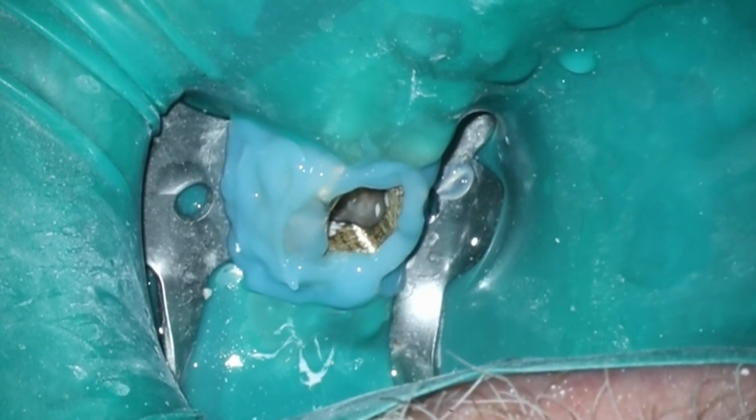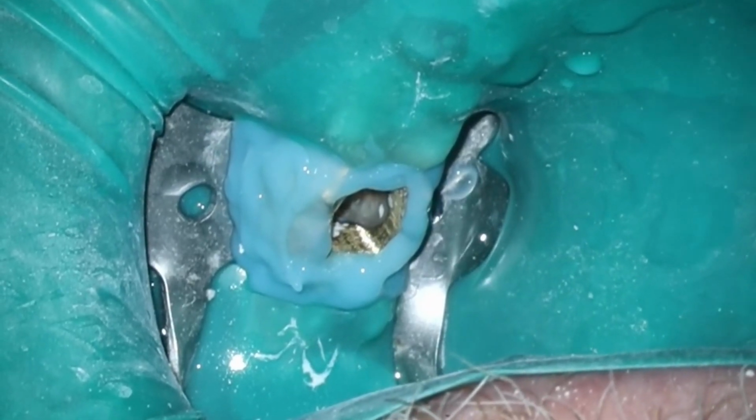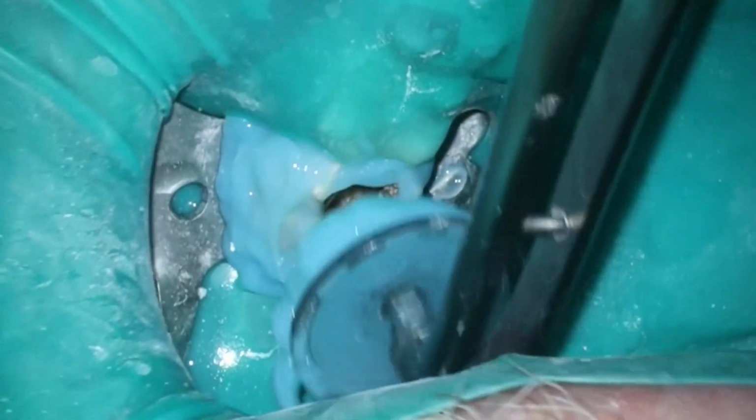Right now, what I'm doing is just putting the SoundSeal on the, what do we call it? Is it a former matrix? I think it's a matrix. Go back to my old video. I forgot about this. I'm really good at knowing what these things are called. The former matrix thingy. I was filling it up there.